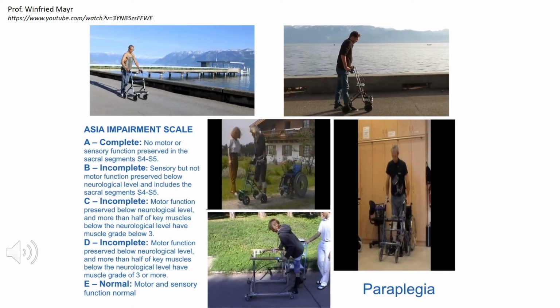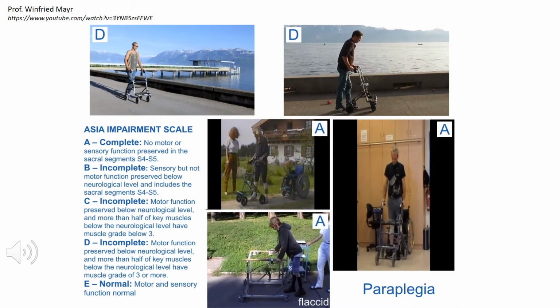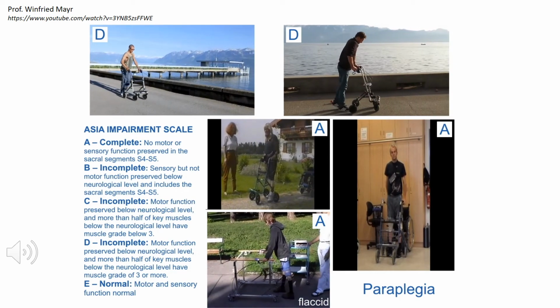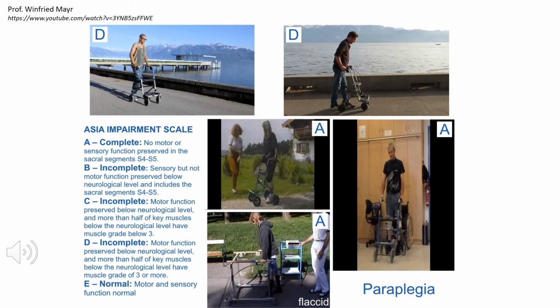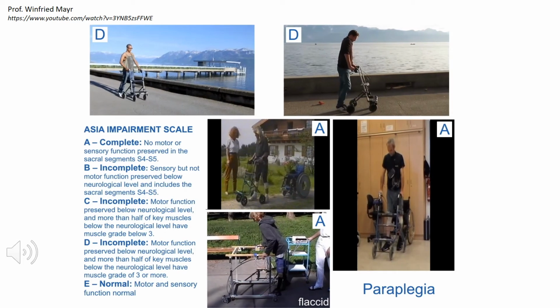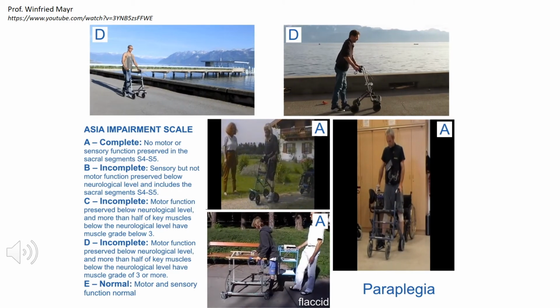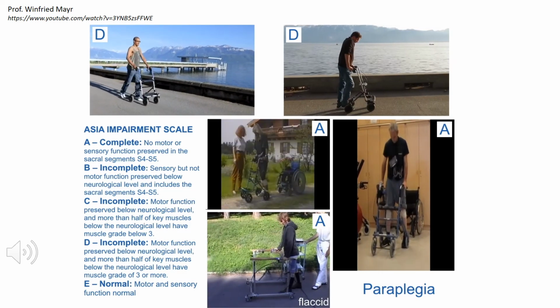Yeah, this should show you where we are over time with restoration of walk, which I think is a long story, and the level has somehow saturated to some extent. We have now 50, 60 years of work on this, and the lower three videos are from the 1990s. The upper two, the most actual and spectacular videos from the group in Lausanne.